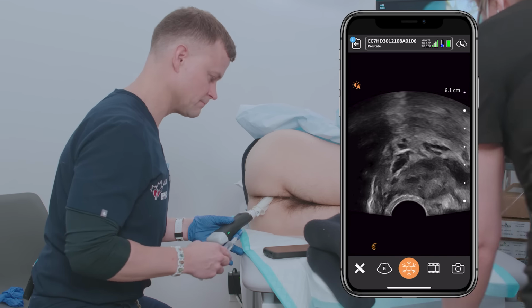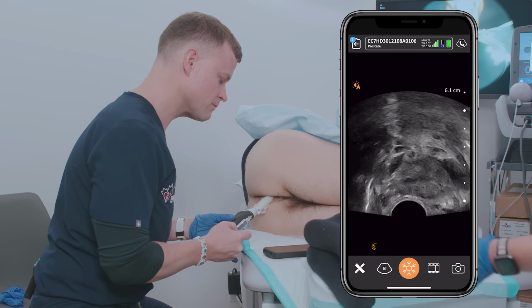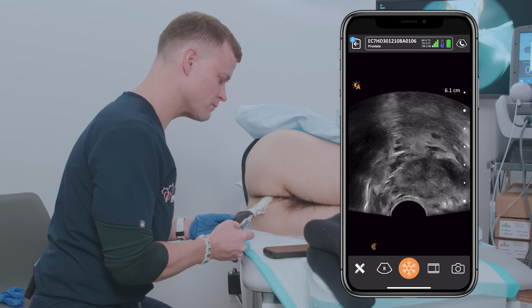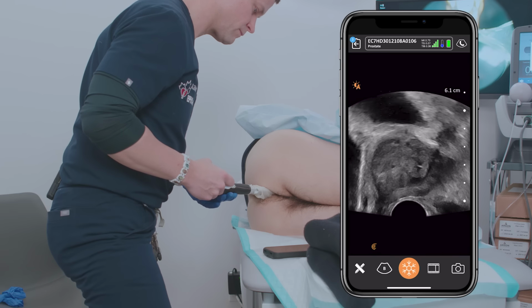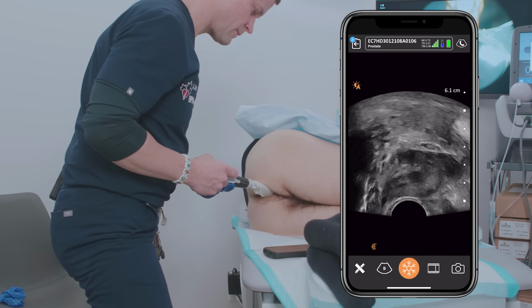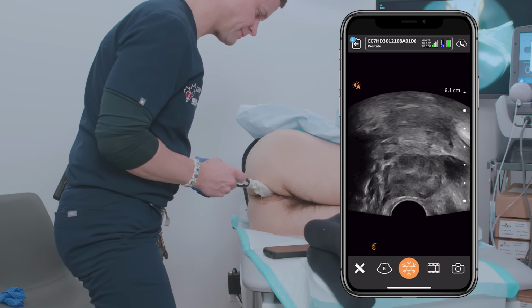But again, careful entry into the space nearing the sphincter and the apex of the prostate and delivering 5 cc's of lidocaine on both the left and the right side. Again, noticing my ergonomic posture, all while gazing at one single image throughout the entire procedure.